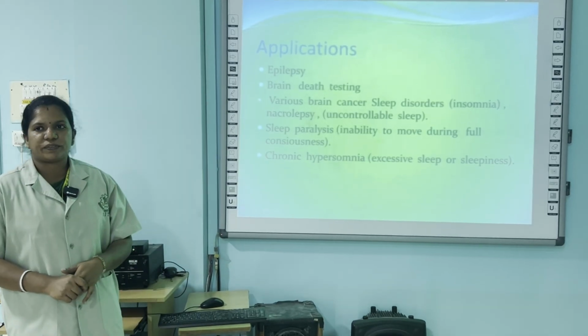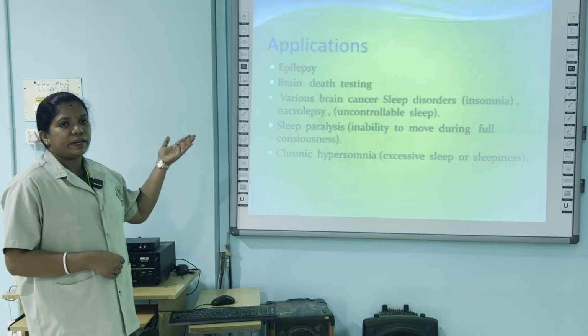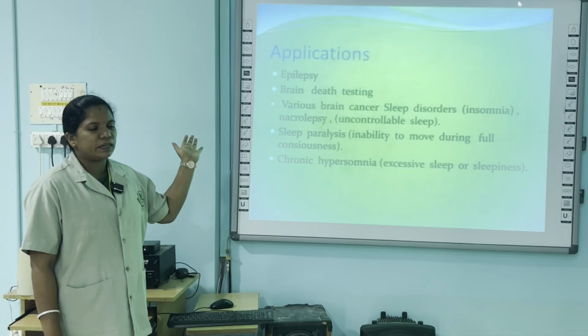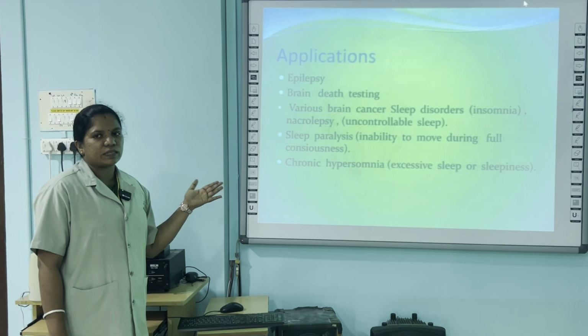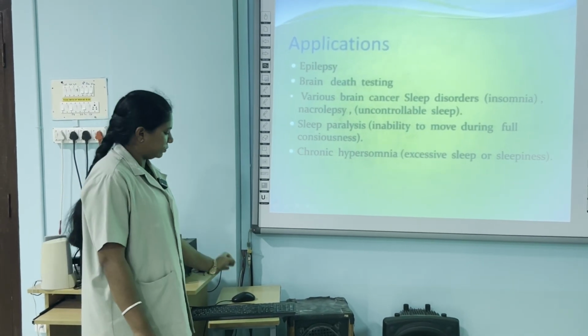So, the applications of EEG are mainly for detecting epilepsy and for brain death testing. In cases of brain cancer or sleep disorders, narcolepsy, this EEG measurement will be done. During sleep paralysis and during chronic hypersomnia or sleepiness, this EEG measurement will be done.